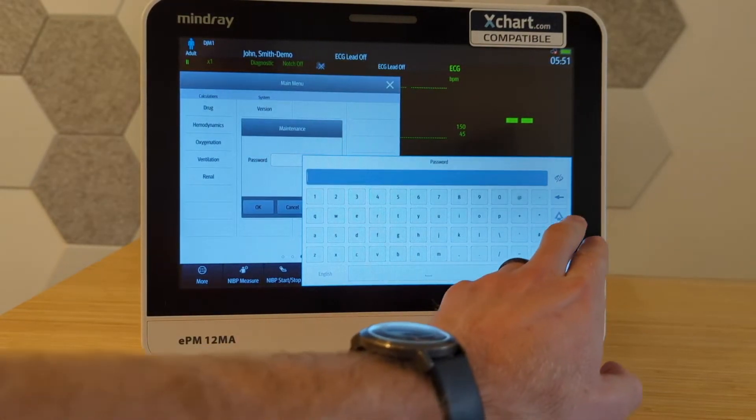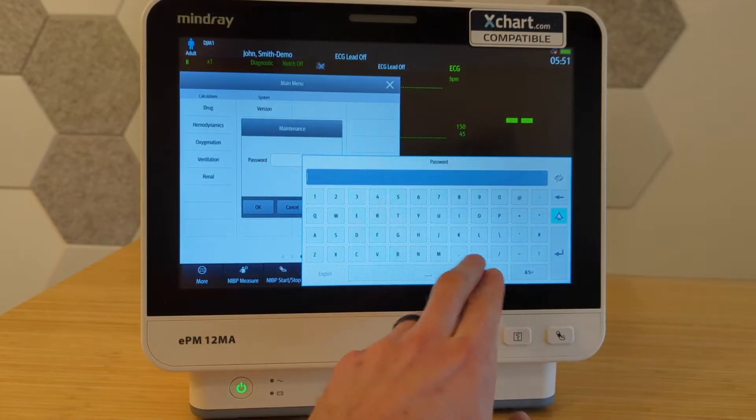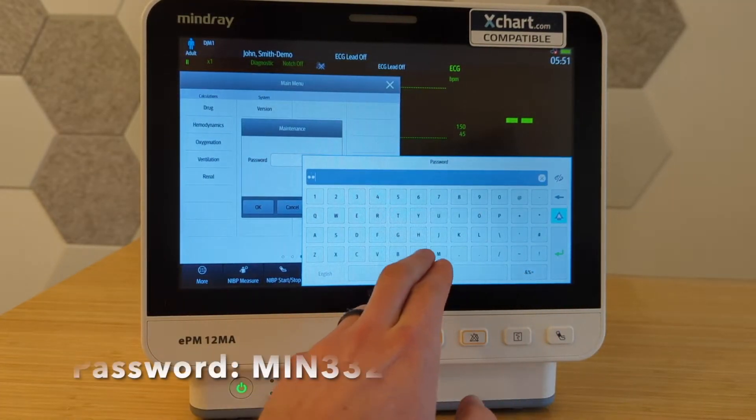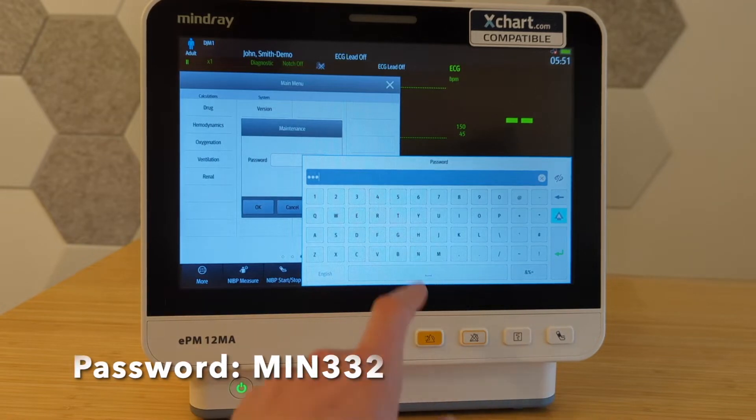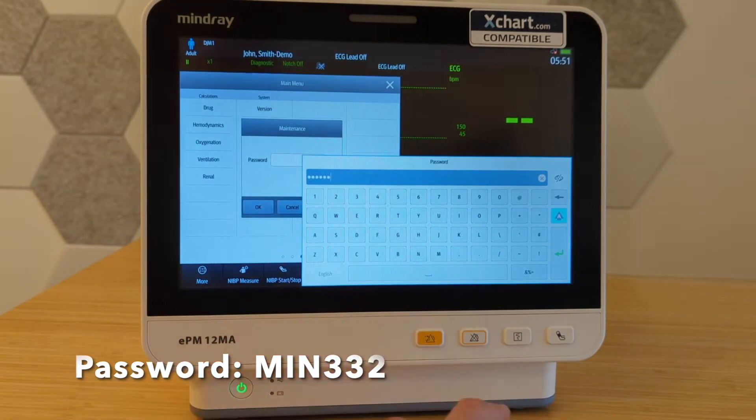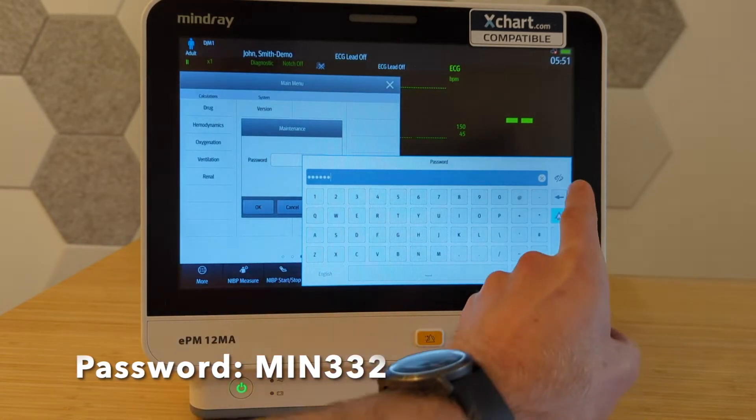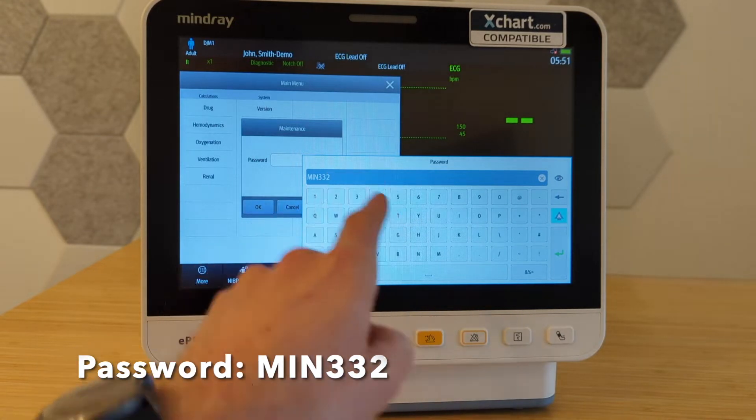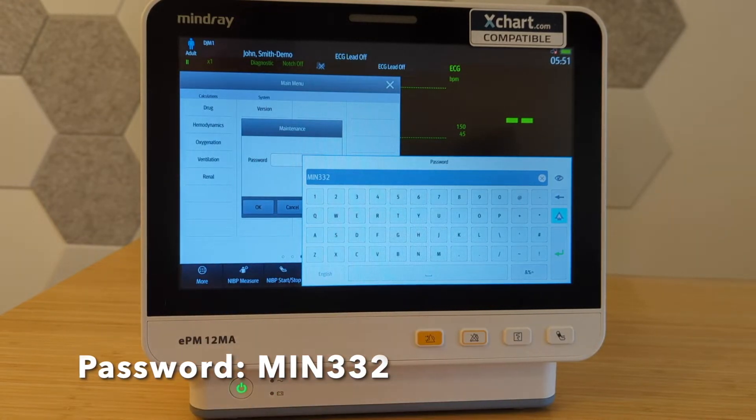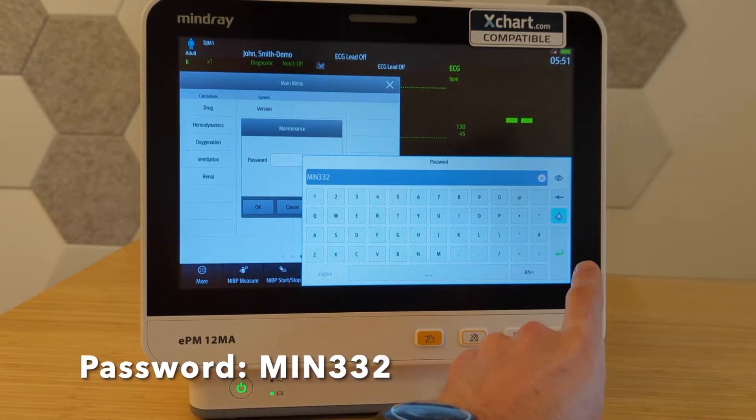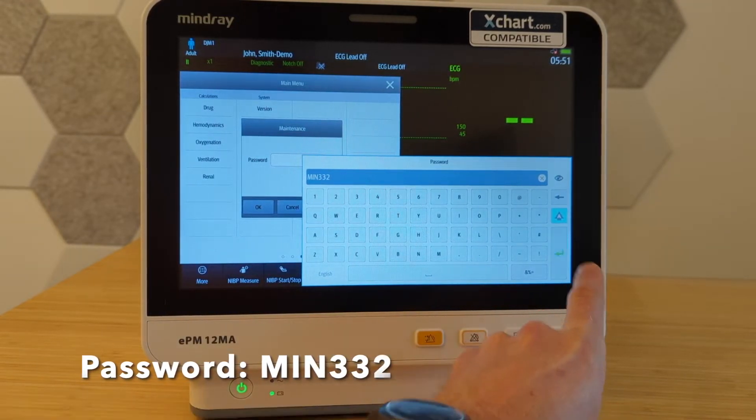And we're going to type all uppercase here, MIN332. If you want, you can hit this little eyeball over here and you can actually see the password. You can see what you typed, make sure you typed it correctly. Hit OK.